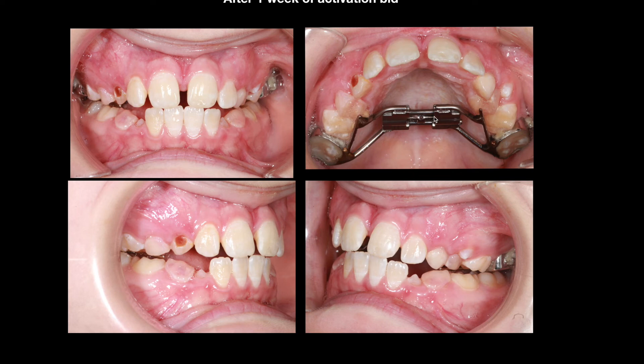The screw is opening nicely, so they're doing good work at home. We start seeing the Curve of Wilson being accentuated. She's still biting on her first molars, but here in the front the bite is opening. After two weeks, we had almost 8 millimeters in between the front teeth.